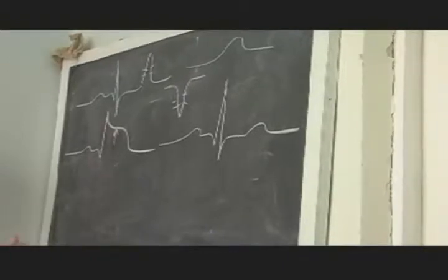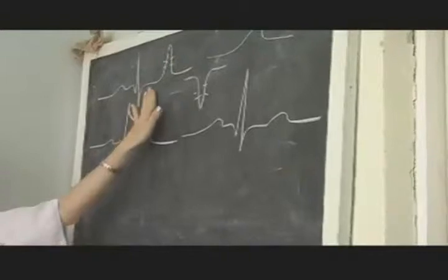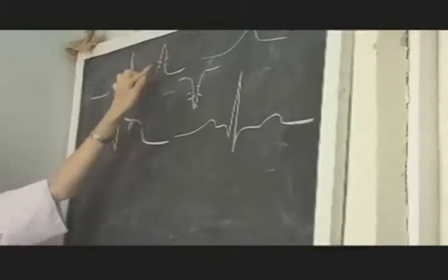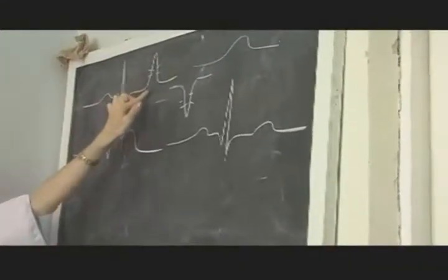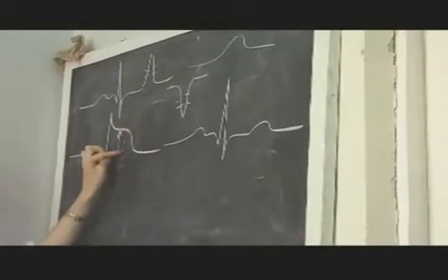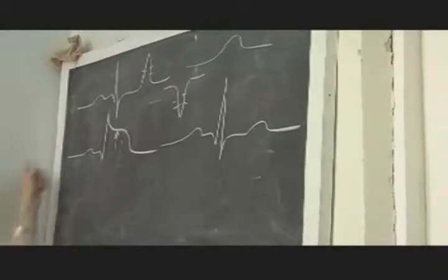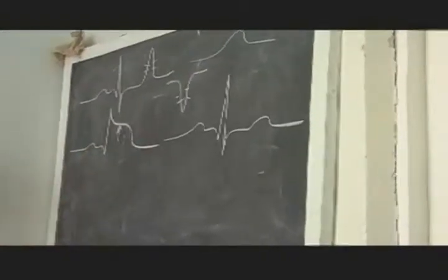The ischemic process is also present because its part is the T wave. But when the ST segment rises, it also moves the upper part of the T wave. And the T wave becomes invisible, but it's present. It's present. It's damage of myocardium.